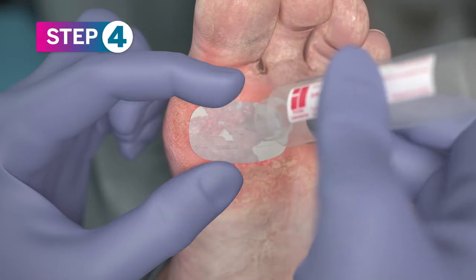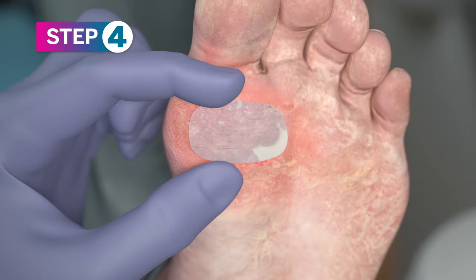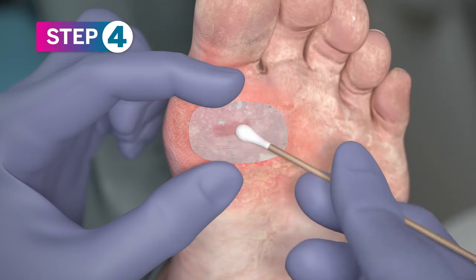Hydrate with saline but do not soak. Press gently with a cotton swab applicator to make contact with the wound bed more complete and uniform.